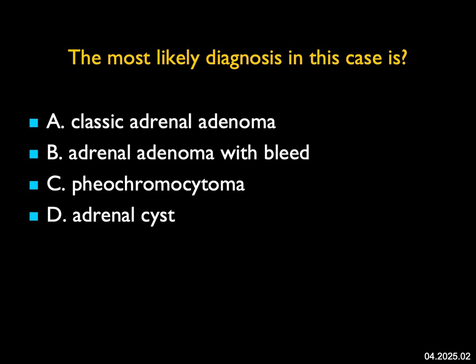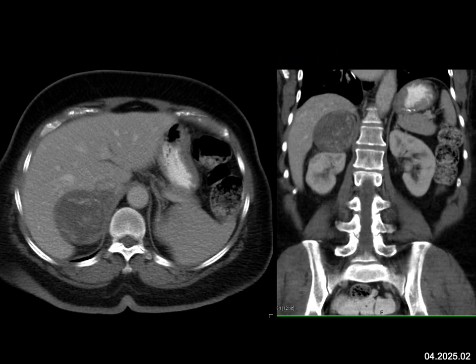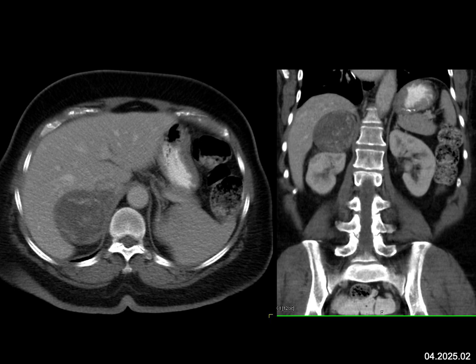The most likely diagnosis in this case — when you look at the axial and coronal views, we see a mass in the region of the right adrenal gland. It has areas of high density, which make us think about a prior bleed. It's not dense enough for calcification. The contralateral left adrenal looks normal. So this doesn't have the look of a classic adenoma, though adenomas can bleed, but they're typically homogeneous in attenuation. Pheochromocytomas are usually hypervascular, but they can be cystic, though you would expect more enhancement.